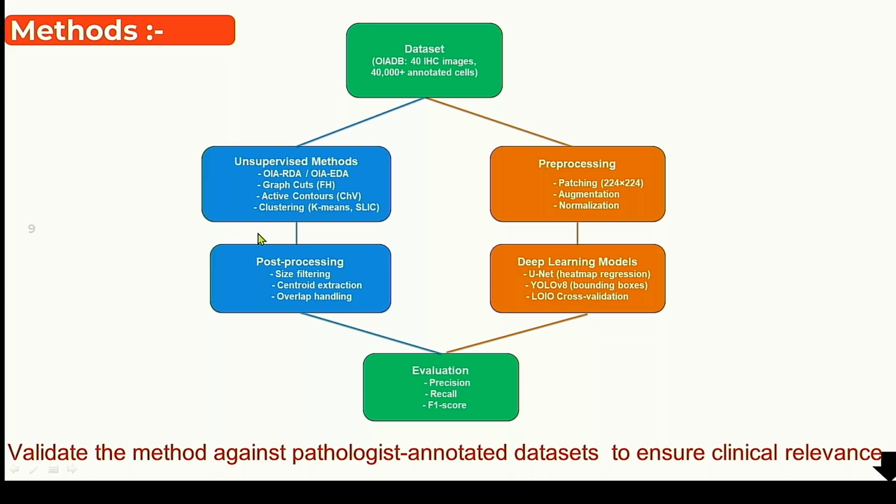We have a problem of image segmentation and object detection, but we can address this problem from two perspectives: unsupervised methods, segmentation, and supervised segmentation methods.